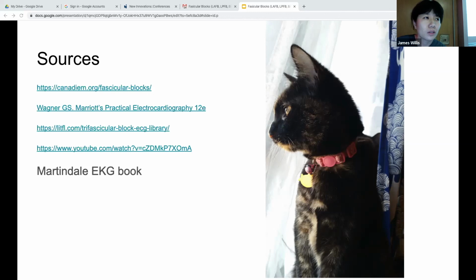The other thing that is very useful for me is that if I find a bifascicular or trifascicular block, either of those, I especially look for them in syncope patients. Because if you see a syncope patient, and even though now they're still in sinus rhythm, but you see they have a bi or trifascicular block, there's a good chance they went into complete heart block or Mobitz type 2, probably complete heart block. And you definitely want to keep those people.